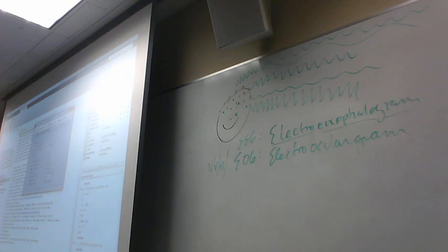Well, why'd you say screen? Oh, that kind of screen. Like a phone or something that makes noise? So we're actually talking about the same thing. You don't know it, but we are. Alright. So what she was talking about is there's electrical noise from the screen. The screen is obviously electrical. There's electrical noise from the light.